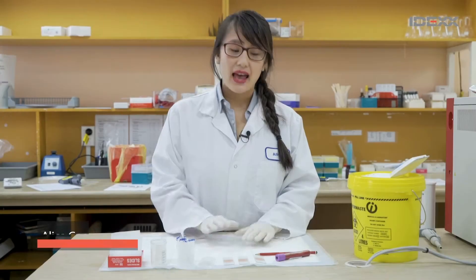Hi, so today we're making a blood smear. It may seem daunting but it's actually not that difficult. All you really need is just a little bit of practice.